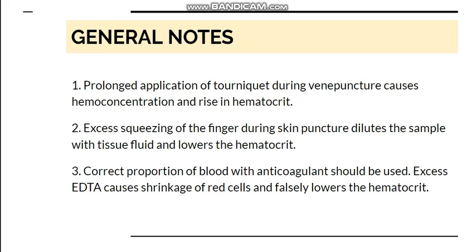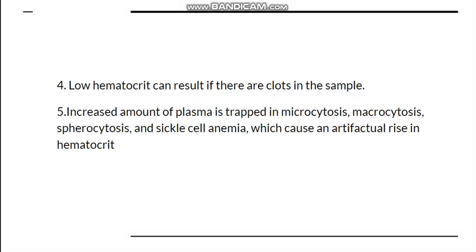Regarding sources of error: prolonged application of a tourniquet during blood collection will increase the hematocrit. Excessive squeezing of the finger during a skin puncture will dilute the sample with tissue fluid, lowering the hematocrit. Also, the blood-to-anticoagulant ratio must be correct — if there is excessive EDTA, it will cause shrinkage of red blood cells, again falsely lowering the hematocrit.